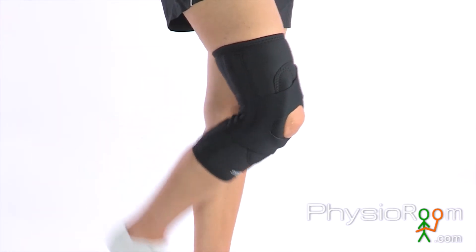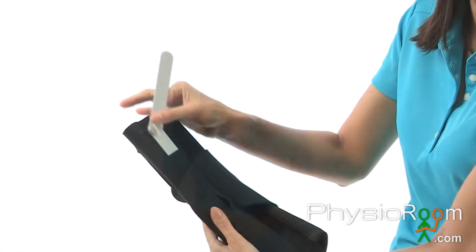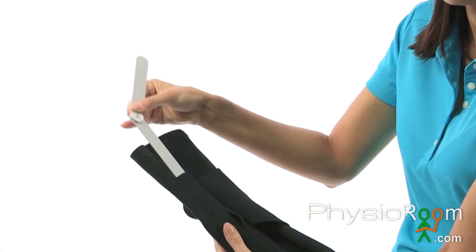The Drytex material is flexible and comfortable for everyday use. The Donjoy Lateral J is available with or without hinges. The hinged version is ideal for those with both knee ligament instabilities and patella tracking issues.